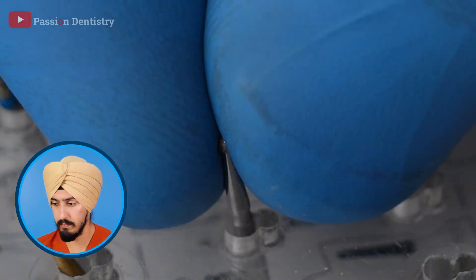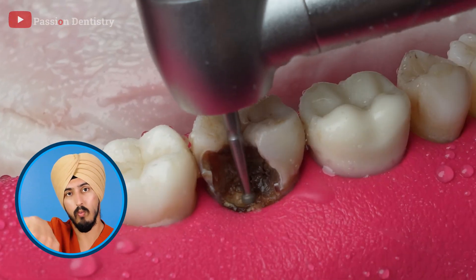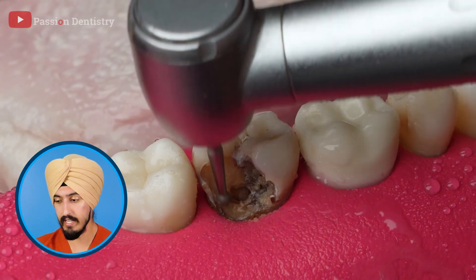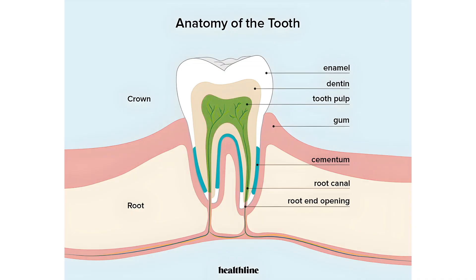So he's got his burr, his handpiece ready, his foot pedal, and now he's just going to start cleaning away. We typically just take this dental drill and start cleaning it away. All the walls around that cavity want to be clean tooth structure, and then you're just cleaning away the cavity in the middle. You can see here that the cavity is actually going into the pulp chamber — we know that because it feels like a dip. The pulp chamber, the middle part of the tooth, is literally just a chamber of blood vessels and nerve supply, so it's going to feel kind of like a drop when you get in there. Typically when you get into the nerve you'll see some bleeding, but if you don't see any bleeding that means the tooth has died. Sometimes if you have a really big cavity and you wait too long to get a root canal, that tooth will actually die and you won't see any bleeding. You might not even have pain, but you could have an infection lingering that you just keep ignoring for too long.